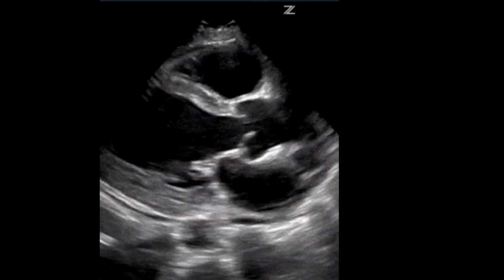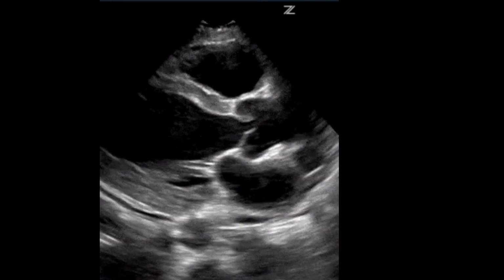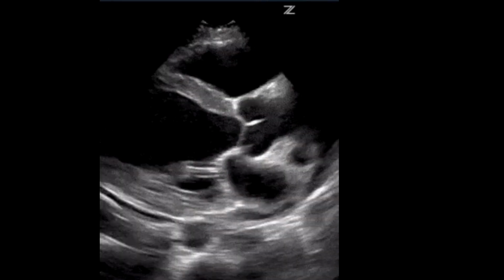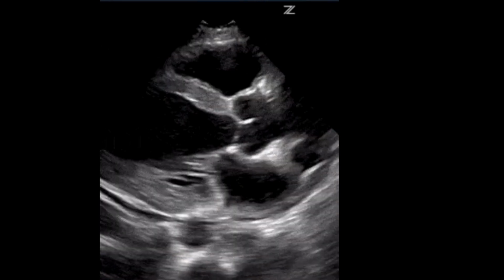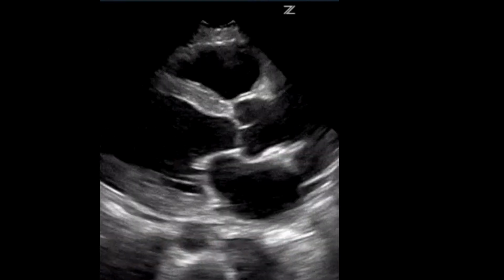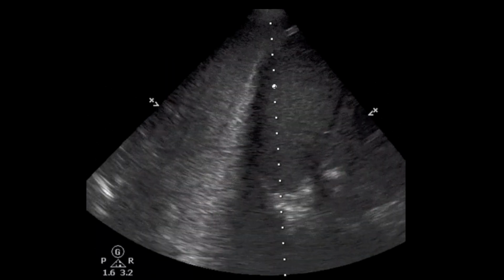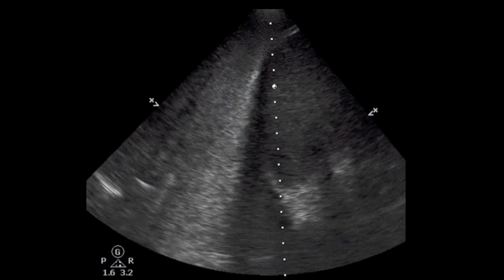You can see that the valves, especially the mitral valve, are not opening as they should. And that's called functional. There's going to be an MR, and this is a functional one. So the valve is not diseased, it's just because it's dilated. Sorry, there were two slides missing. I'll just tell you what was in there.